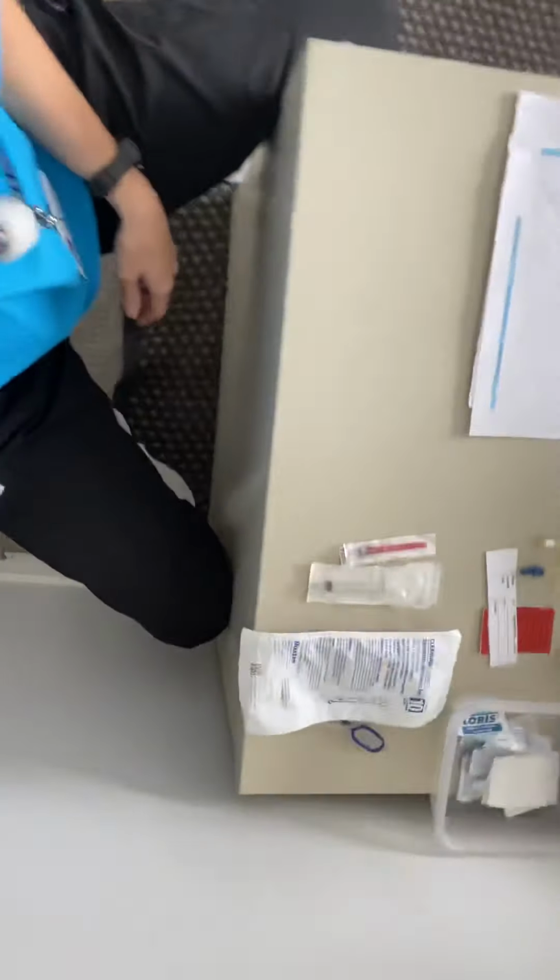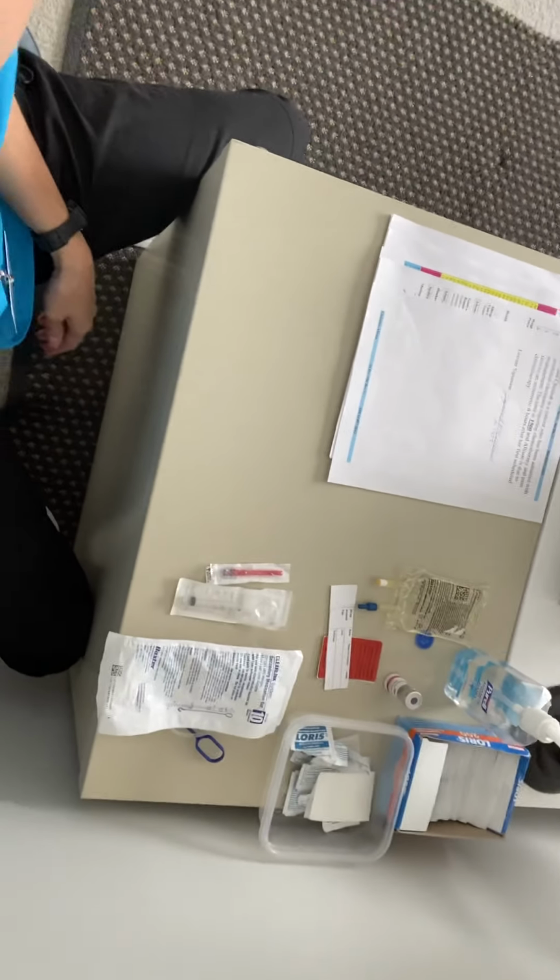Today I'll be demonstrating for you medication administration via the IV piggyback. Before I get started, I'm just going to show you a scan of my room. So this is my office space with all the supplies I need for the assessment. And then around me, it's an office, so it is dirty, nothing on the whiteboard, but there is a bit of a mess here, but this is our station and it is quite clear there.